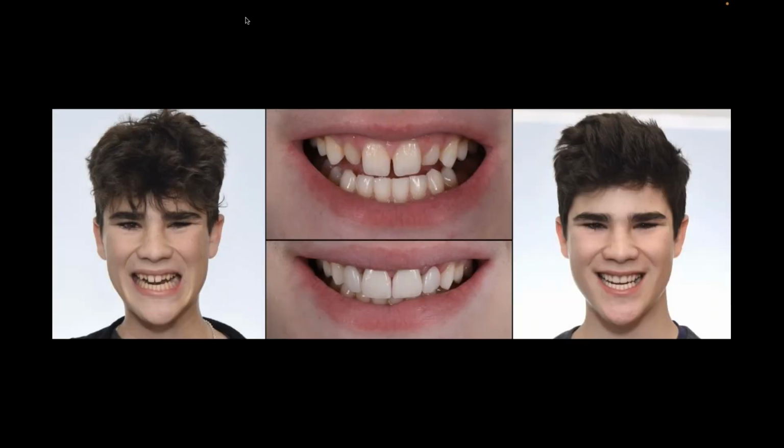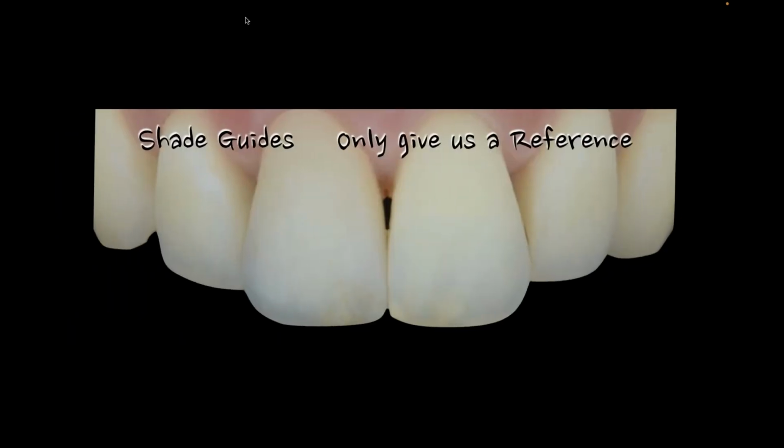So we were kind of lucky in the sense that we were doing 4 teeth. Because we're doing 4 teeth, it allows us to not worry so critically about matching the other teeth. Really what we're worried about is harmonizing in the face and with the other teeth. But with other restorations, with single tooth restorations, or maybe 2 teeth, and sometimes even 4, really having reference points to figure out what color we want to make those teeth is critical for us.